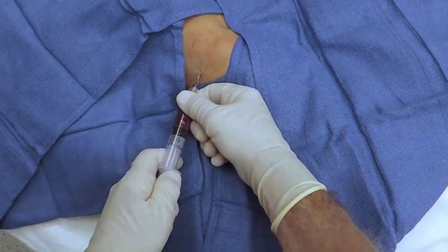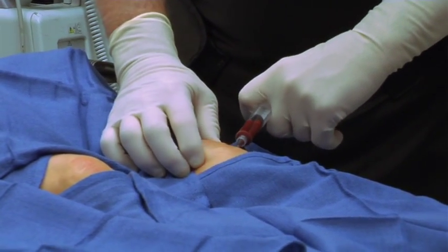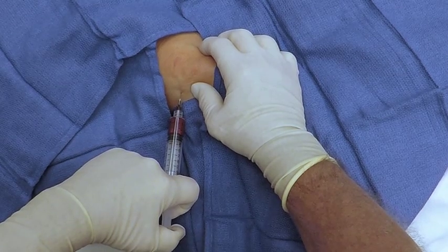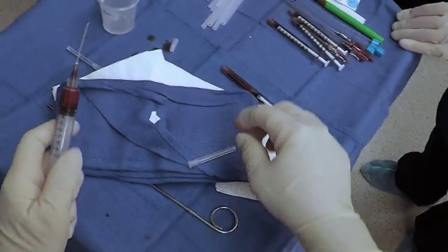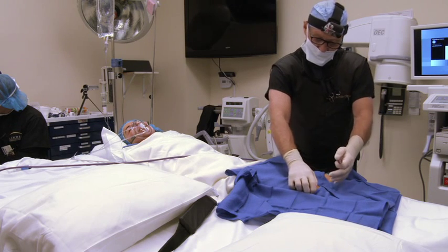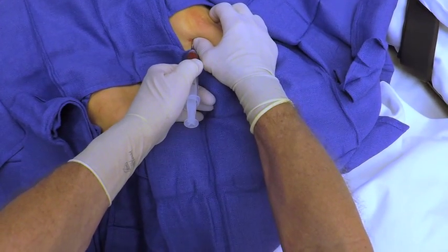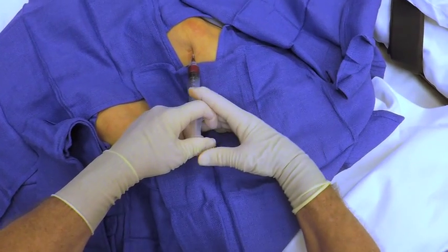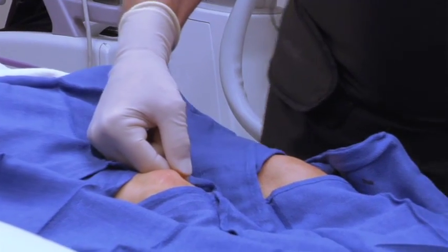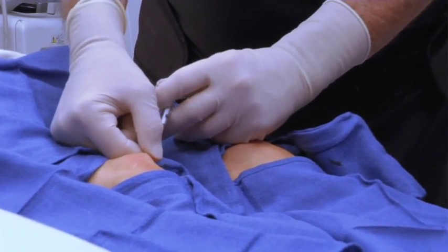Then we're going to go to the other side and do the same thing — this other side from the medial side of the joint. And we are done.